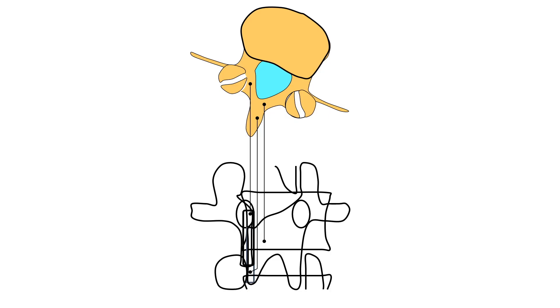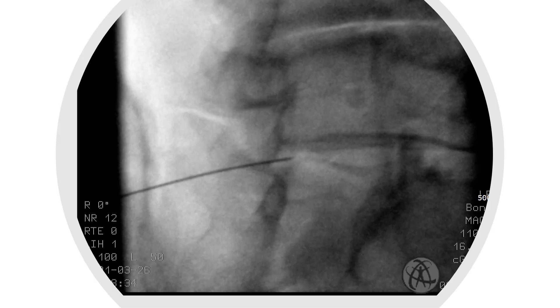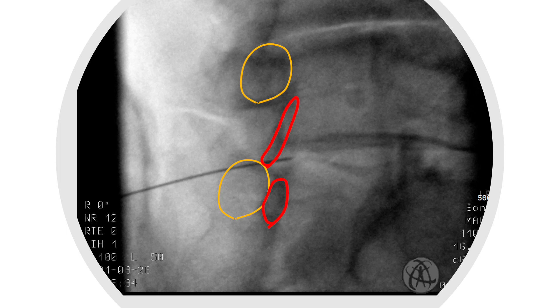I'll show you the schematic drawing of the correlated image once more. The lamina and pedicle are located in this crowded area. If you approach from the left side, use the right oblique image. The yellow circle is the left pedicle. The red circles indicate the profile of the cut section of the lamina.